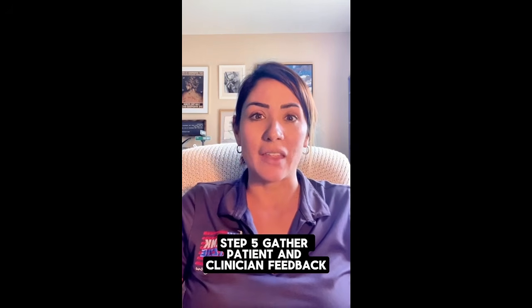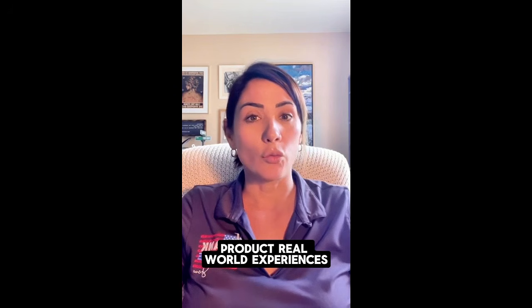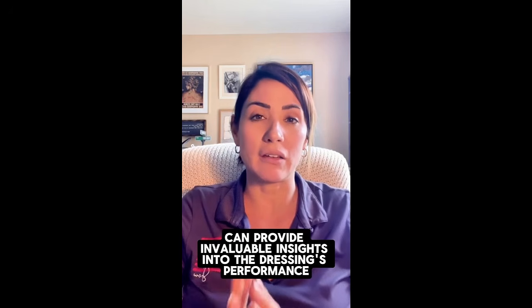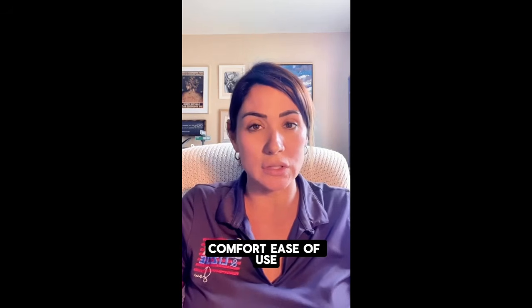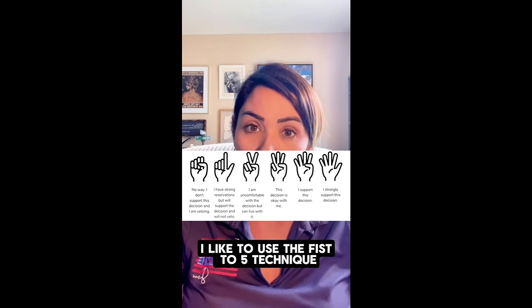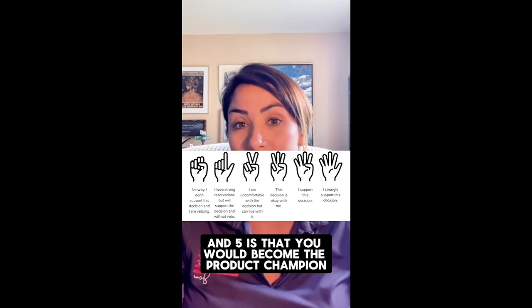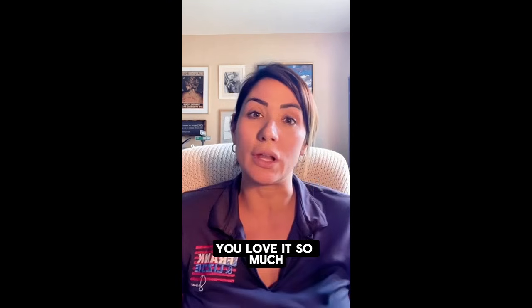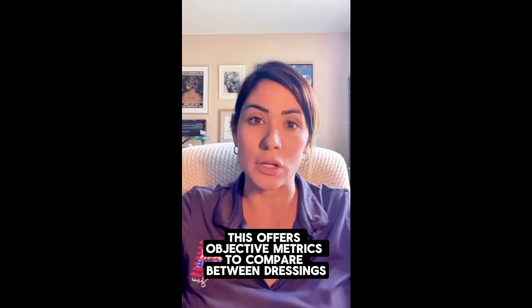Step 5, gather patient and clinician feedback. So consider feedback from both patients and clinicians who have used the product. Real-world experiences can provide invaluable insights into the dressing's performance, comfort, and ease of use. I like to use the fist of 5 technique, where the fist means you would actively fight against bringing the product in, and 5 is that you would become the product champion. You love it so much. This offers objective metrics to compare between dressings.